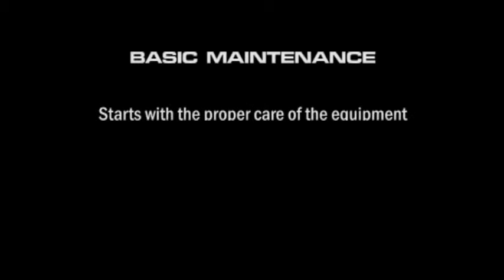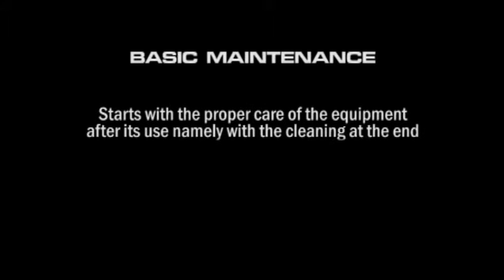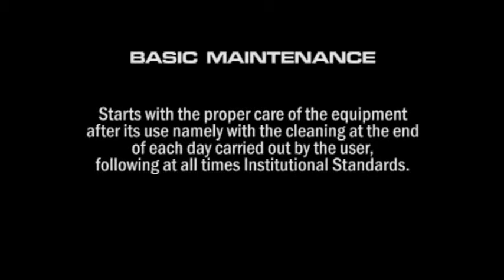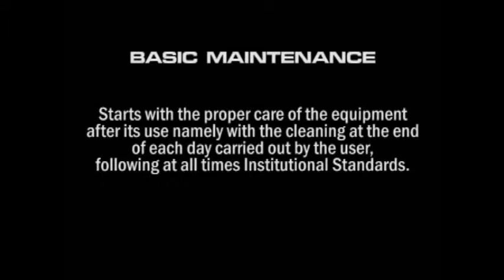Maintenance. Although maintenance refers usually to some repair or calibration procedures carried out by maintenance technicians, it starts actually with the proper care of the equipment after its use, namely with the cleaning at the end of each day carried out by the user, following at all times institutional standards.